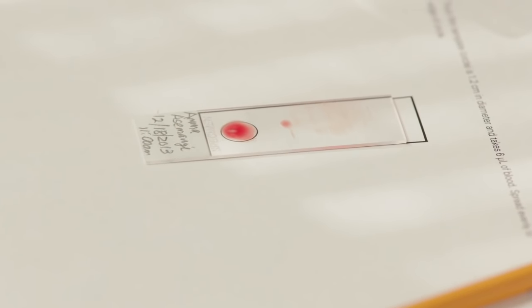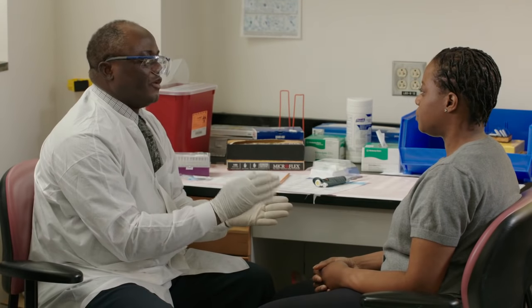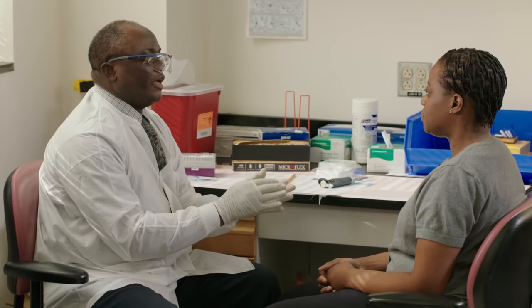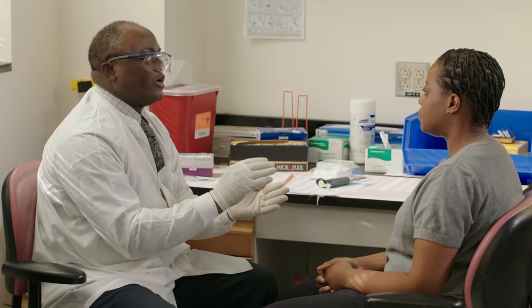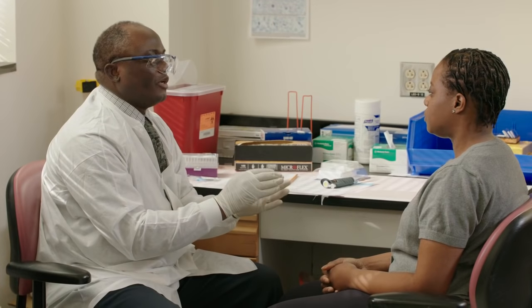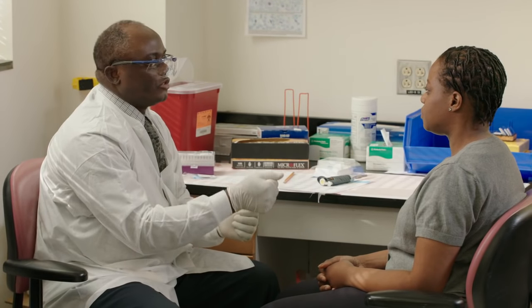Ama, thank you very much for your cooperation in the sample collection. We are going to process your blood sample to find out whether you've got a malaria parasite in your blood or not. Come back in one hour's time. By that time we will finish processing the sample, and we'll give you a result to take back to the doctor for further action. Thank you. Bye.